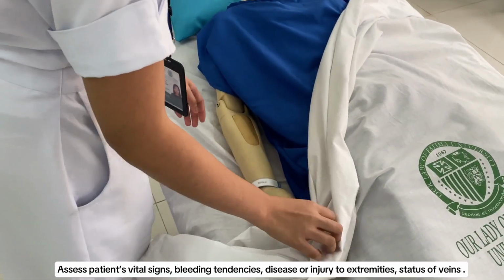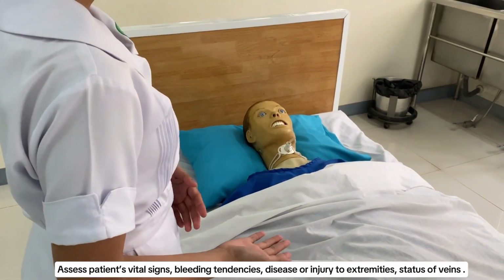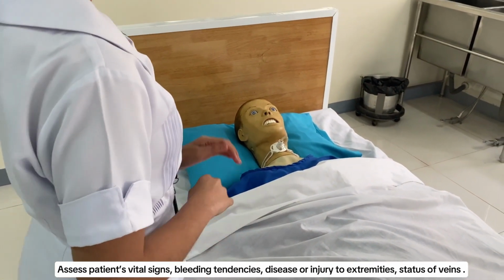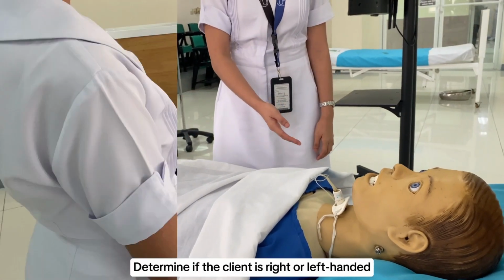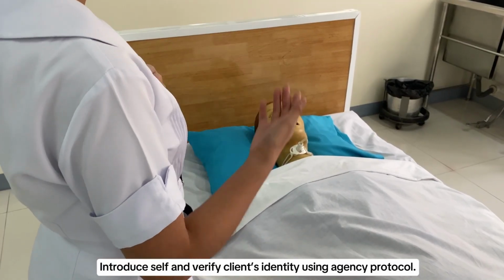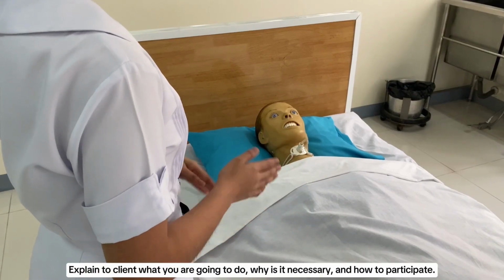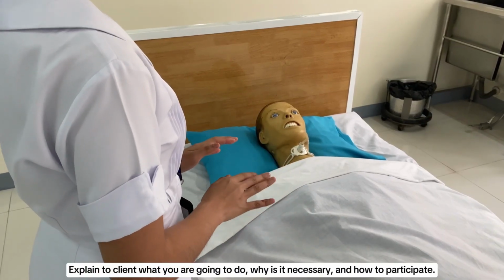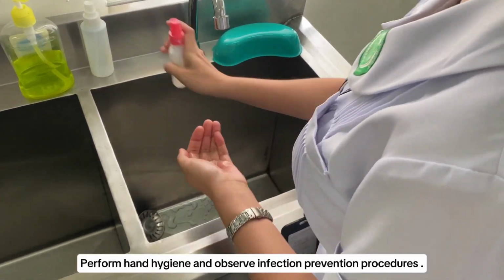Assess the patient's vital signs, bleeding tendencies, disease or injury to extremities, and status of veins. Determine if the client is right or left-handed. Introduce yourself and verify the client's identity using agency protocol. Explain what you're going to do, why it is necessary, and how to participate. Perform hand hygiene and observe infection prevention procedures.